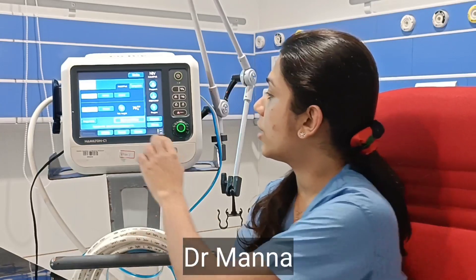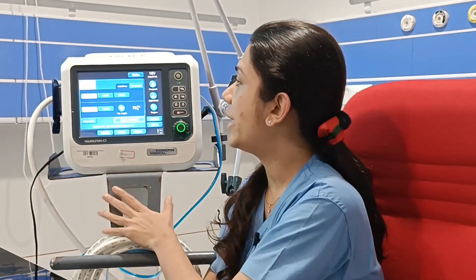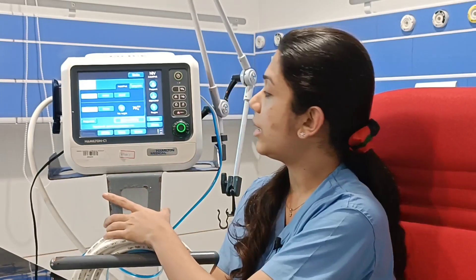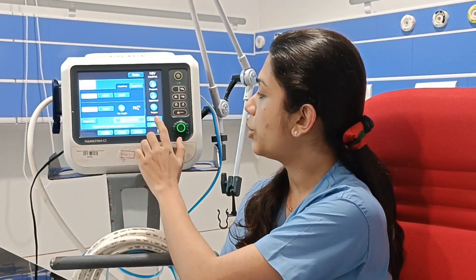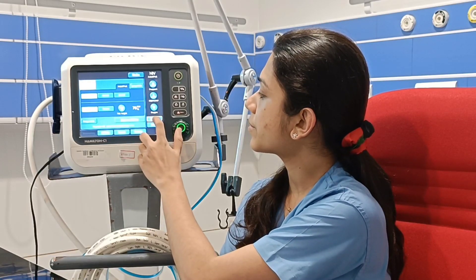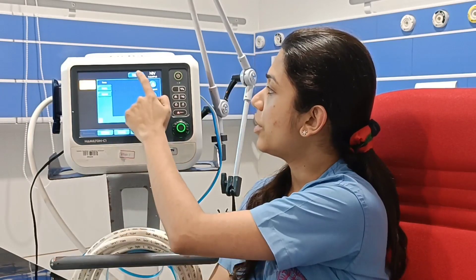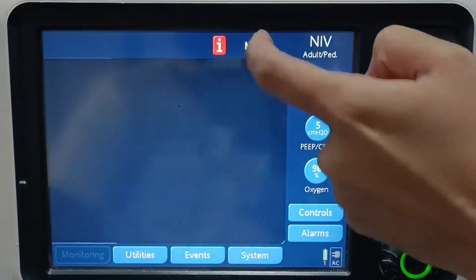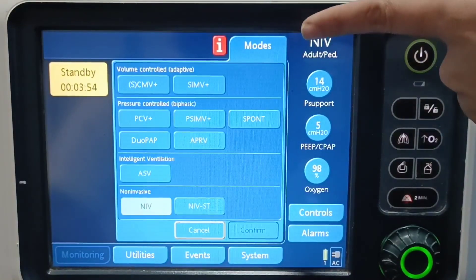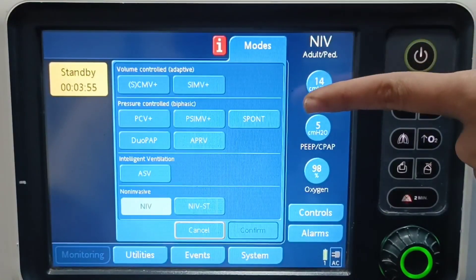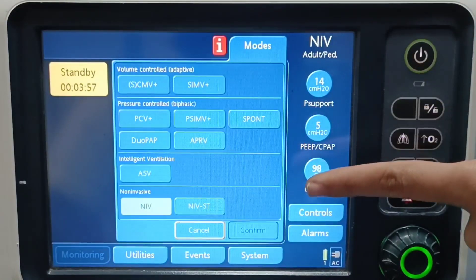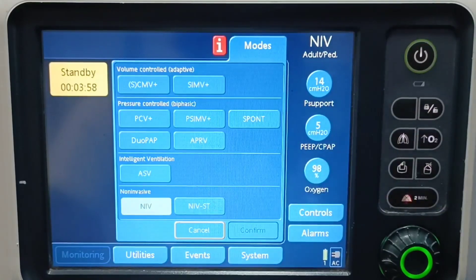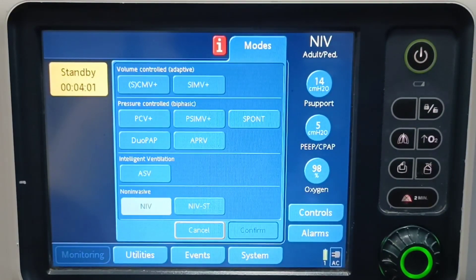We have different modes in our ventilator. When we turn on our ventilator and go to controls, we have the mode options. We have different modes: the volume control mode, the pressure control mode, the intelligent mode, and non-invasive modes.